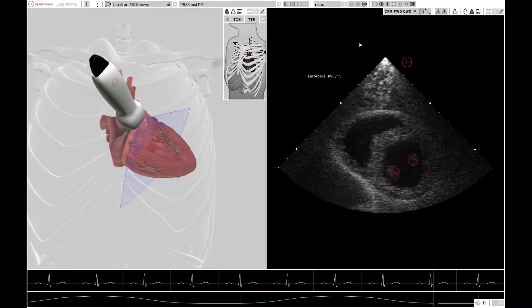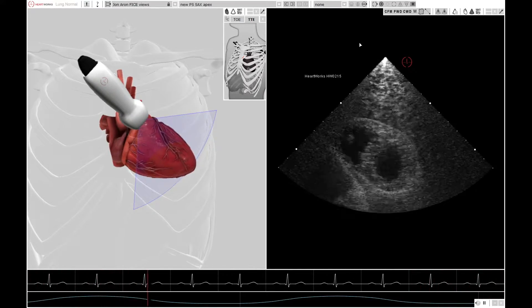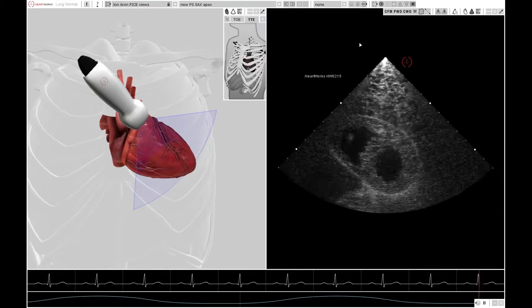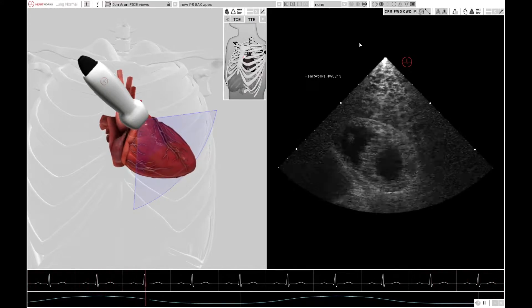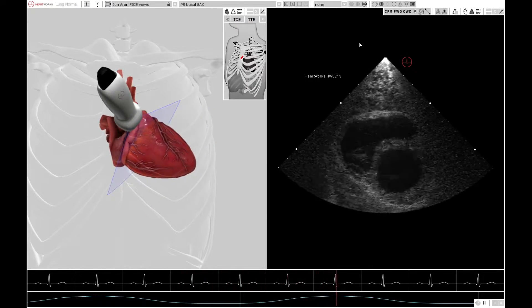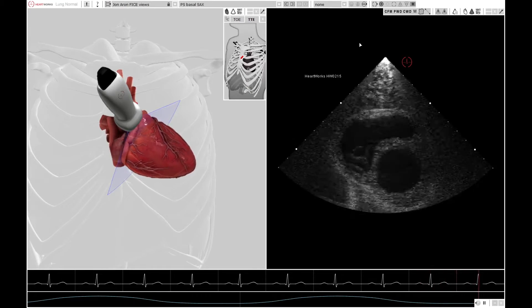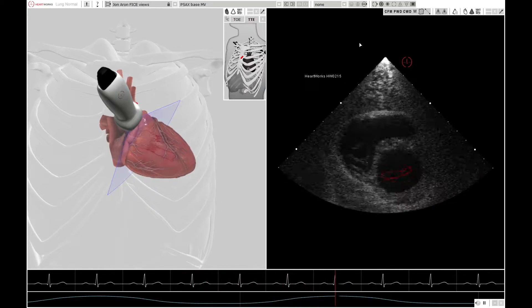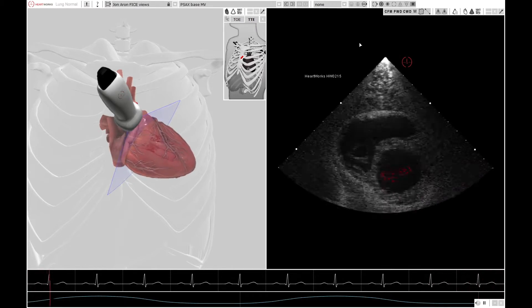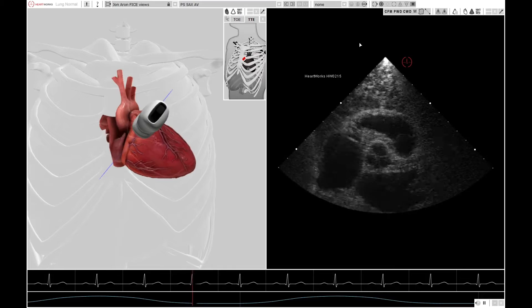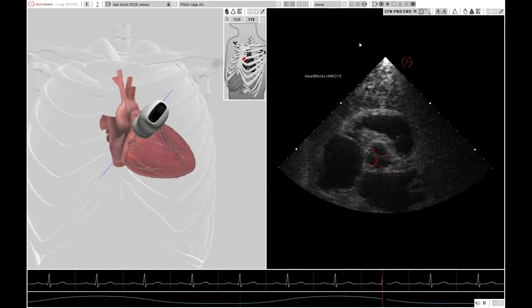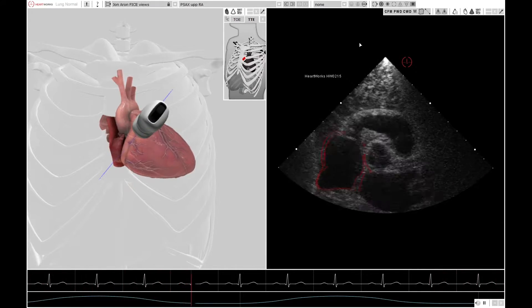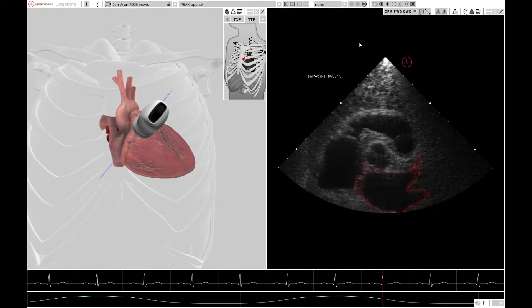By tilting the probe down towards the apex, the papillary muscles disappear — now you're imaging the apex, but it's not a FICE view. If you accidentally look at this view and think you're at midpapillary level, you may think the left ventricle looks hyperdynamic. By tilting the probe back towards the head, you see the base of the heart and mitral valve leaflets — don't mistake this for midpapillary level, as you may think the ventricle is hypo-contractile. Tilting even further towards the head gives a short axis view of the aortic valve, along with the right ventricle, right atrium, and left atrium — interesting, but not a FICE view.